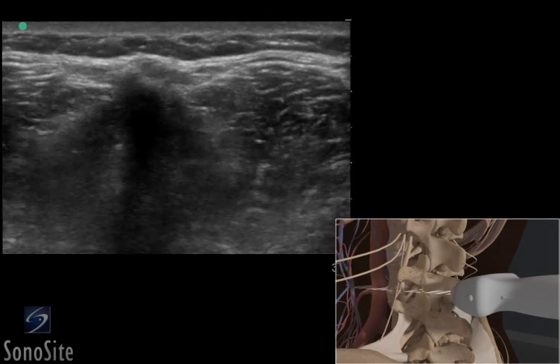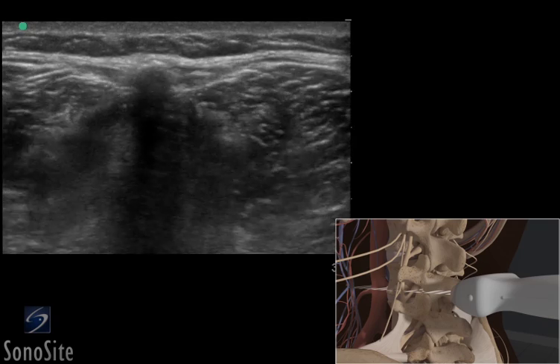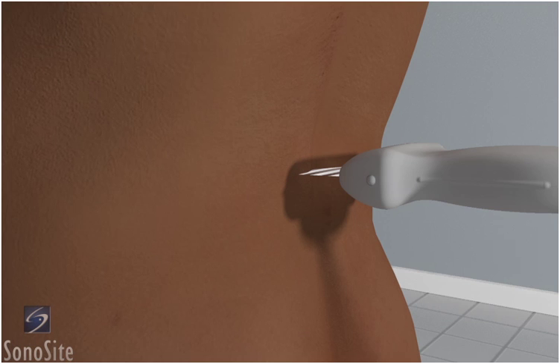A linear array transducer with a superficial exam type is used to perform an ultrasound-guided lumbar puncture. The patient is placed in a sitting position with the spine maximally flexed.